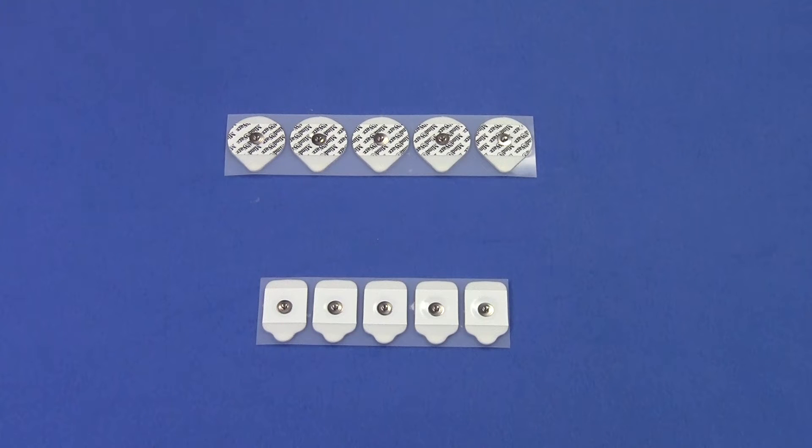Also note that GSC electrodes are different from those used for ECG or impedance cardiography. They're rectangular in shape and contain a different concentration of conductive gel.